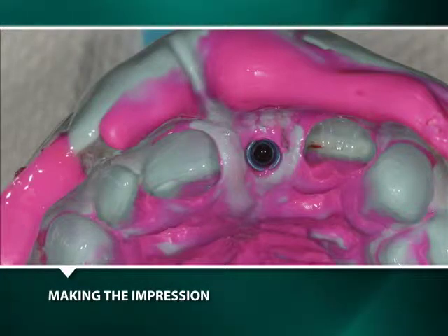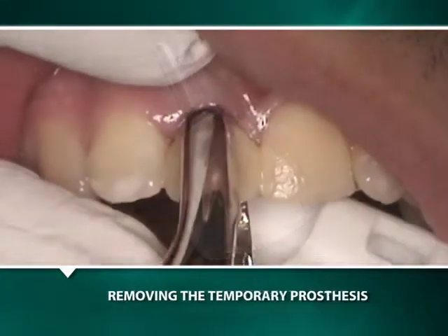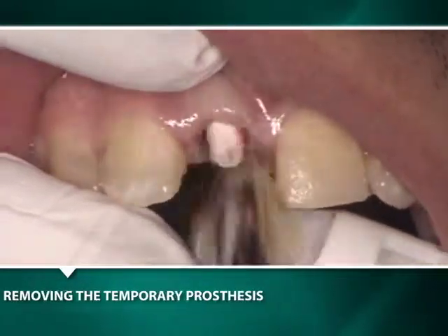Prior to the insertion of the laboratory-fabricated cementless and screwless integrated abutment crown, the transitional crown and plastic abutment is removed from the implant well.